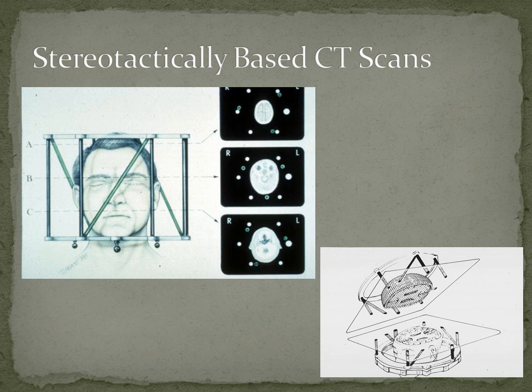Okay. So what happens in a stereotactic CT scan is that we attach this ring. This has what we refer to as fiducial rods on it. There are 9. The tooling balls then lock into the ring, as we discussed earlier. Once they lock into the ring, we know the geometry of these bars relative to the patient, relative to the ring. And by localizing these bars, then we can process the image. And we know where every pixel, every voxel of that image is. And this is just kind of a picture of a map showing that we've actually kind of digitized this and calculated all of the coordinates relative to these rods.